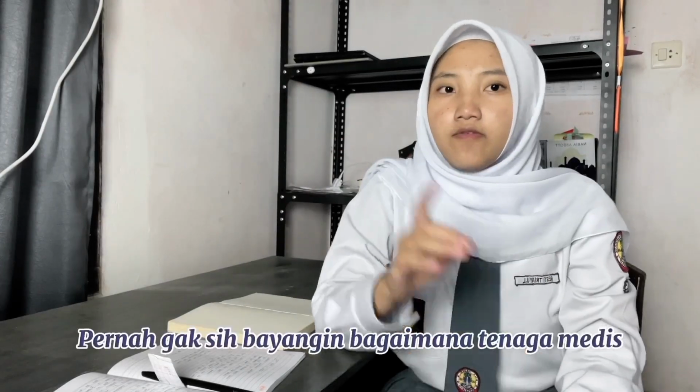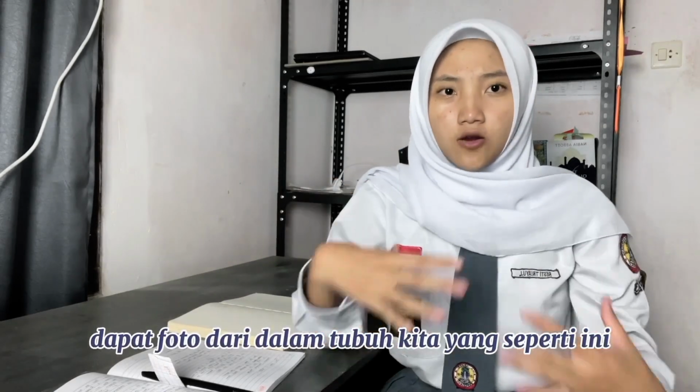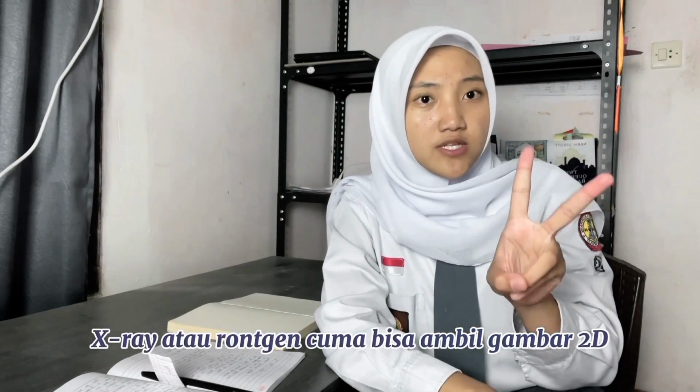Friends! Have you ever wondered how medical professionals get images of inside our bodies like this? If you say from Rontgen, well, you are wrong, because X-ray or Rontgen can only take two-dimensional images. Here are the differences between X-ray, CT scan, and MRI.